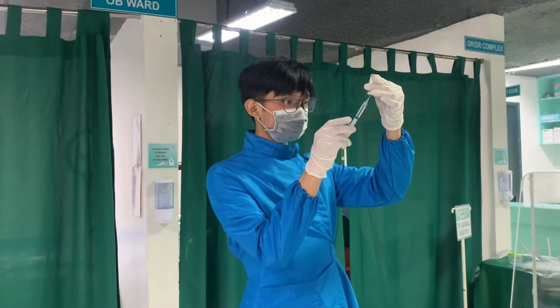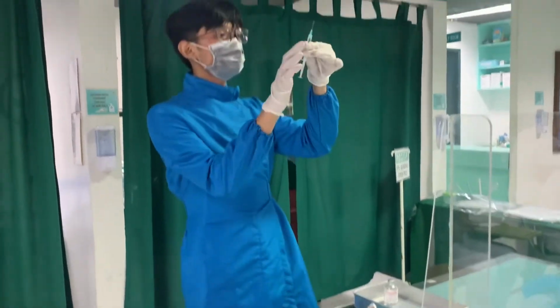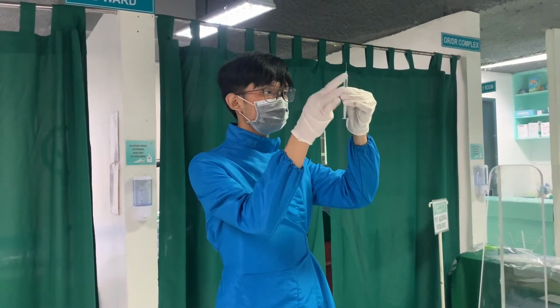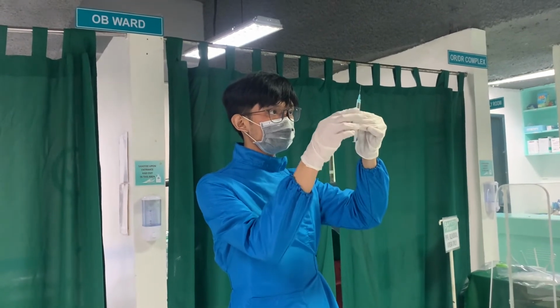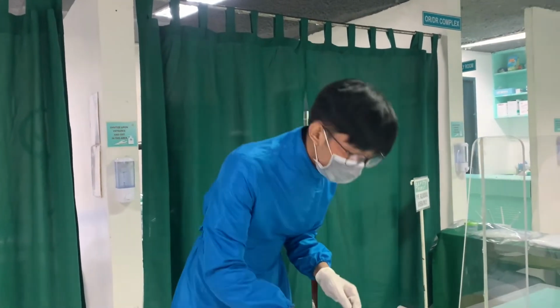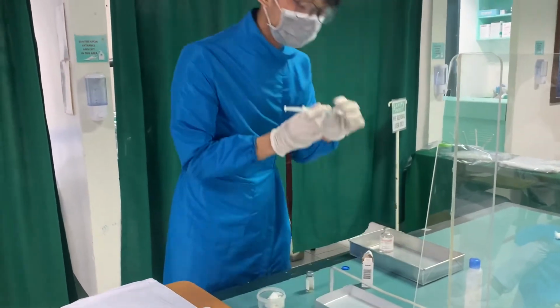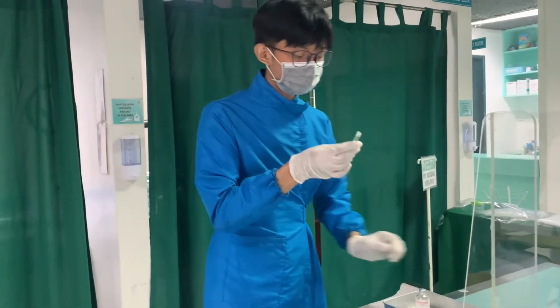Touch the plunger at the knob only. Draw up the prescribed amount of medication while holding the syringe vertically at eye level. If any air bubbles accumulate in the syringe, tap the barrel of the syringe sharply and move the needle past the fluid into the air space to re-inject the air bubble into the vial. Return the needle tip to the solution and continue withdrawal of medication.